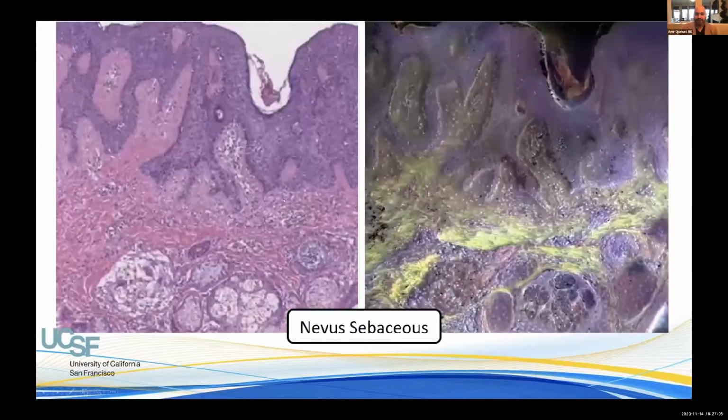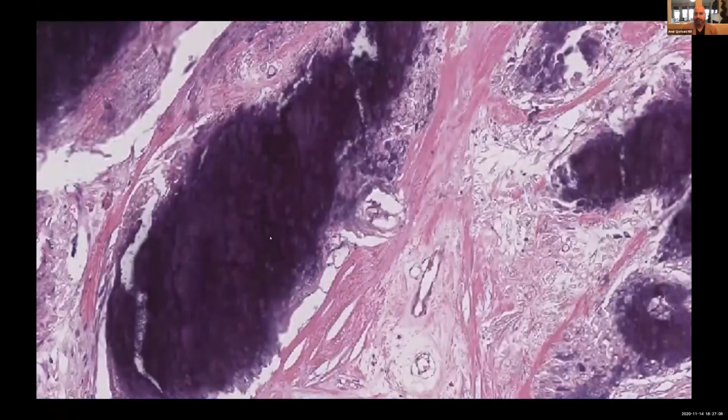For example, this is the H&E, which is what we usually diagnose the disease on. The ghost cells here are close to calcification, which is a dark purple. And because calcification is very hard to cut, it causes these clefts in the regular traditional cutting. And we miss that, and as a consequence, we miss the diagnosis.